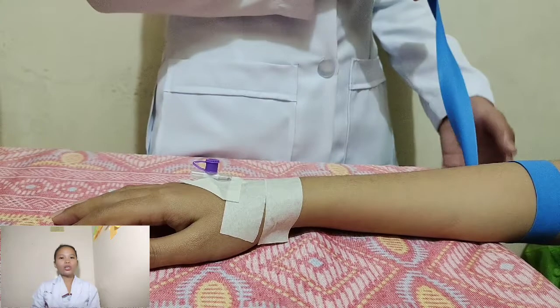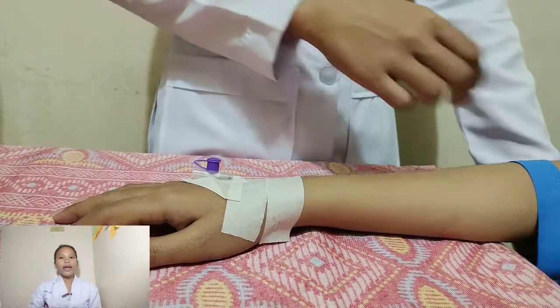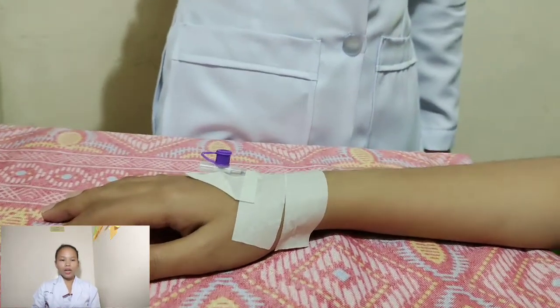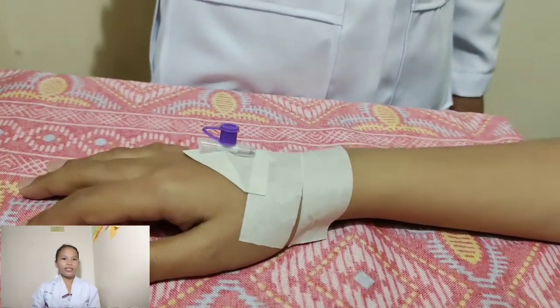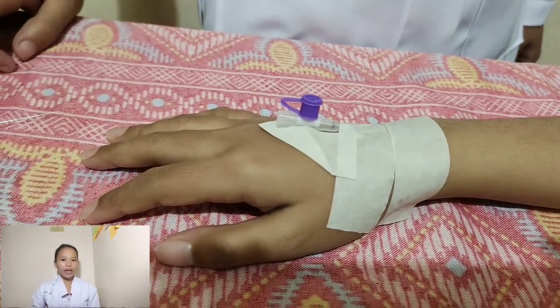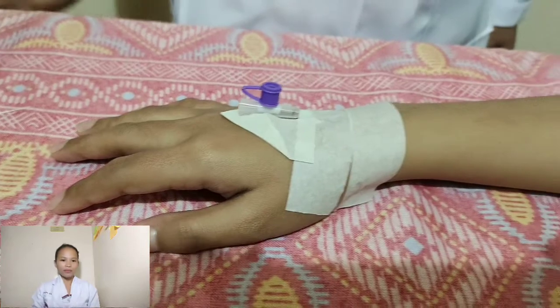Hand the tourniquet to the doctor or nurse, followed by a cotton ball with alcohol and the needle or vasocan. Observe while the doctor or nurse is inserting. Anticipating the needs of the doctor is one of the good characteristics of a nurse. Release the tourniquet when he or she indicates, or when a return flow of blood to the adaptor is observed, or optionally it can be done by the doctor. The tourniquet causes increased venous pressure, resulting in automatic backflow, an indication that the needle is inserted into the vein.